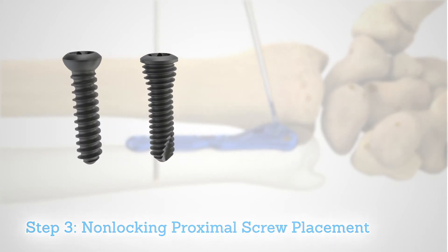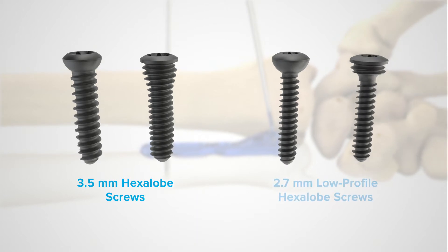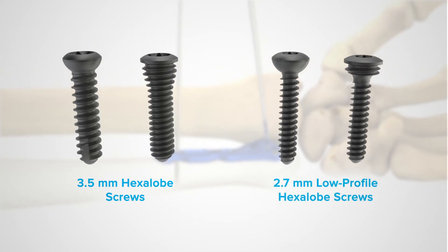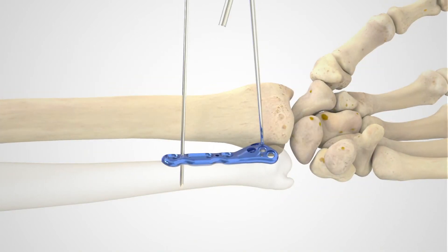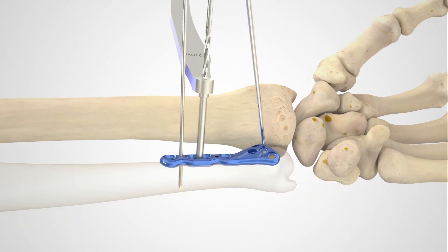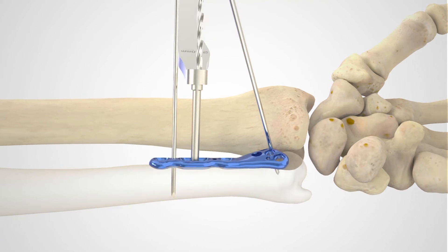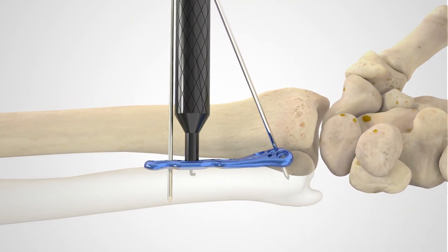The proximal holes in the plate can accept non-locking hex or hexalobe 3.5 millimeter screws, or the 2.7 millimeter low-profile hexalobe screw. If a 2.7 millimeter low-profile hexalobe screw is preferred, utilize the 2.0 millimeter quick release drill with the 2.0 millimeter to 2.8 millimeter thin drill guide and drill to the far cortex.